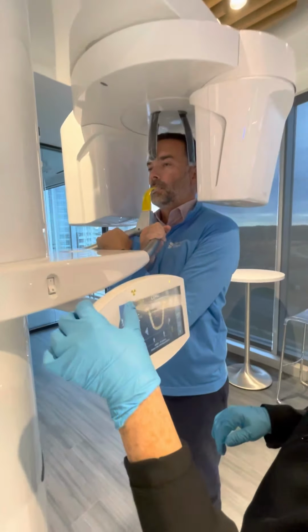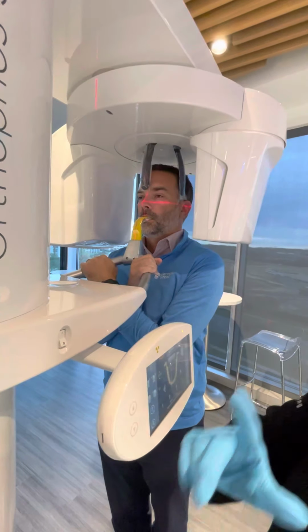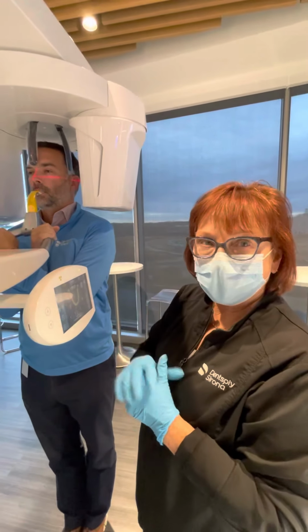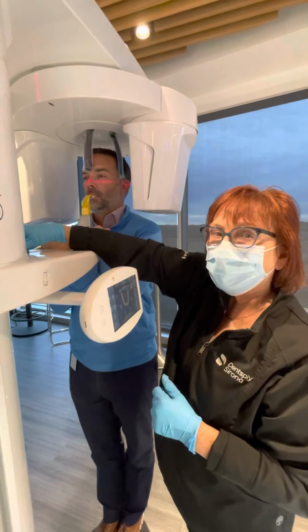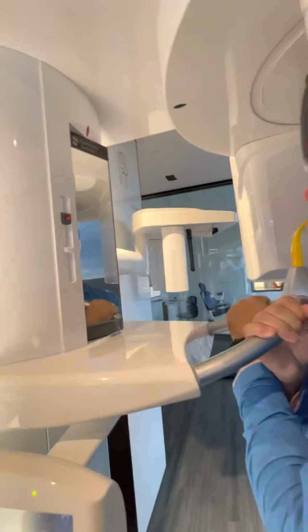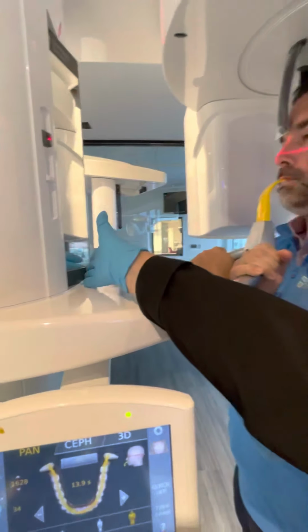Okay, I always ask the patient to center the red vertical line themselves, and we want them to position that to the dip in their lip. I always use the mirror to confirm, never assume, and he is perfectly aligned. You can see it's right to the dip in the lip. Then I always come back and close the mirror.